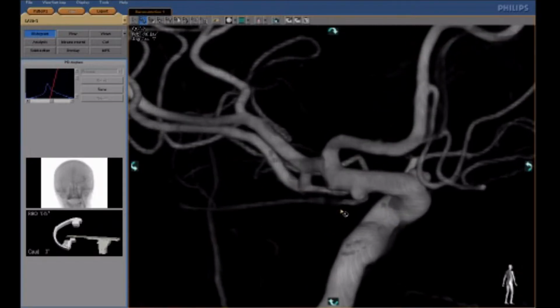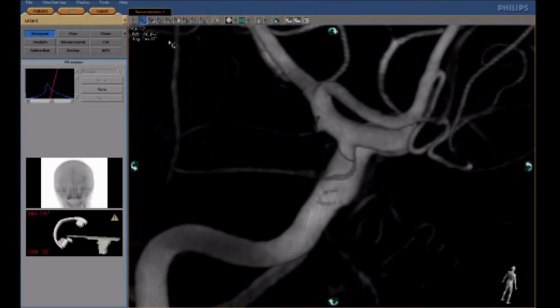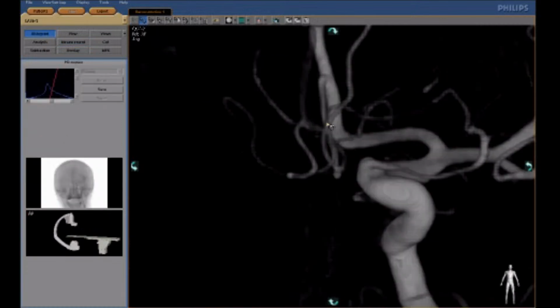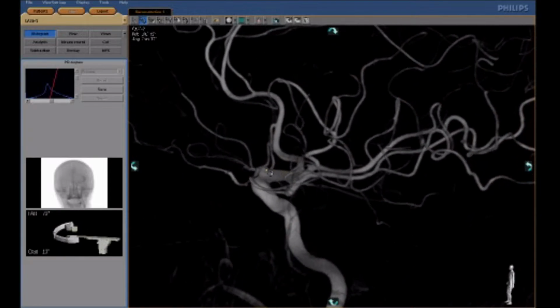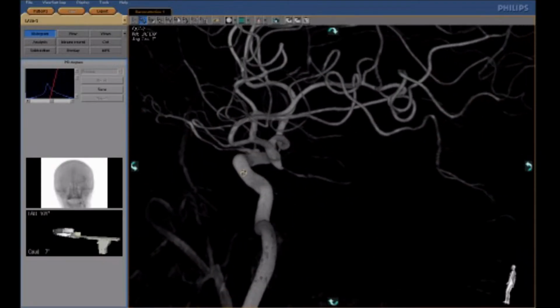Now we have a patient with headaches. The patient went for MR, and during the MR angiography, our neuroradiology colleagues noticed that the patient has an aneurysm. We made an angiography, and now we confirm that in the ophthalmic segment there is a microaneurysm and the segment is dysplastic.